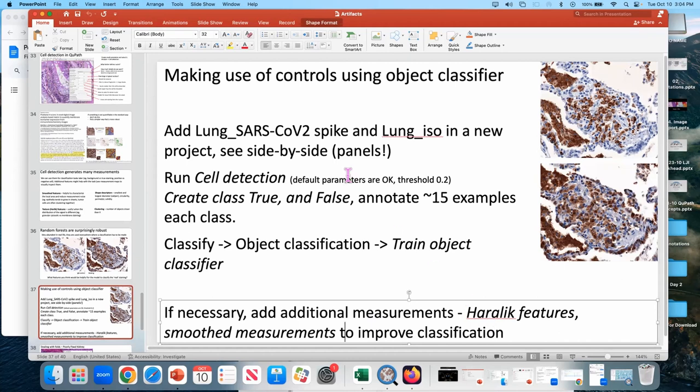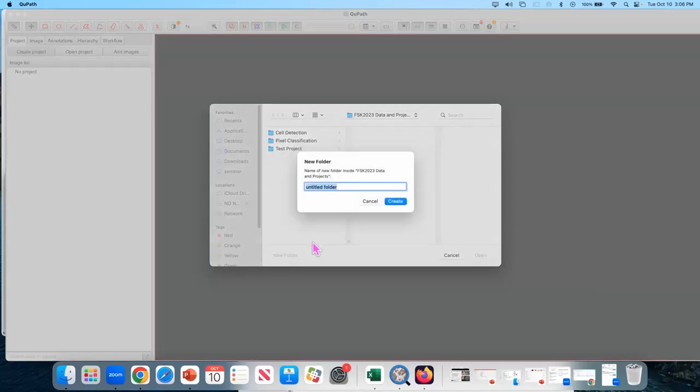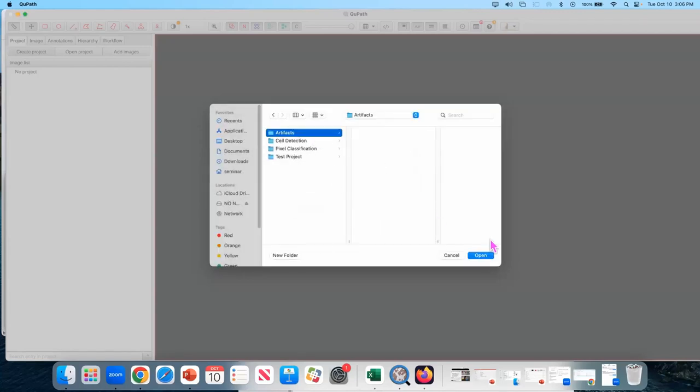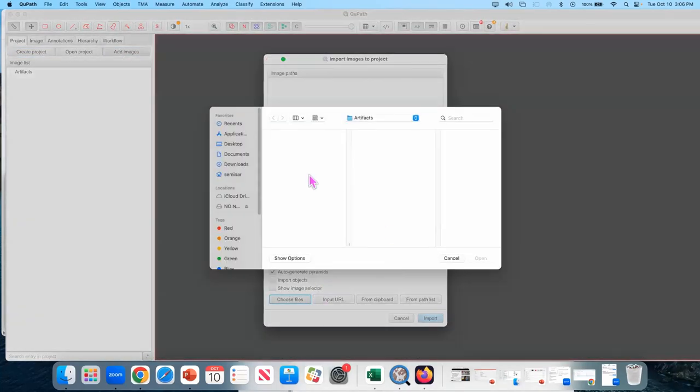So go ahead and open lung SARS-CoV-2 and lung ISO into a new project and see them side by side. Use two panels to see them side by side. Okay, so we're going to add those two images.